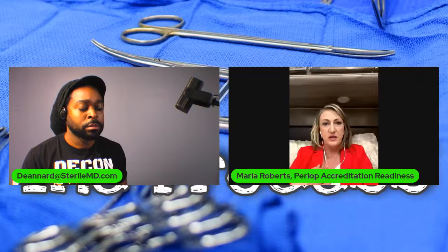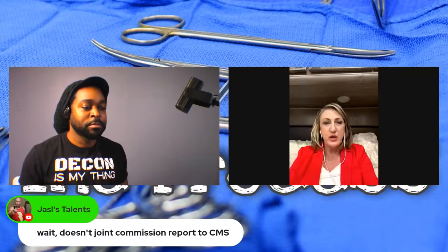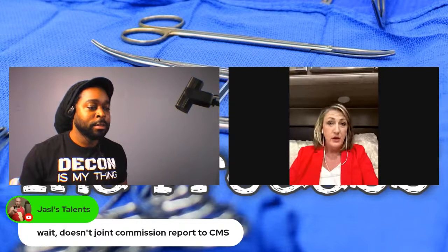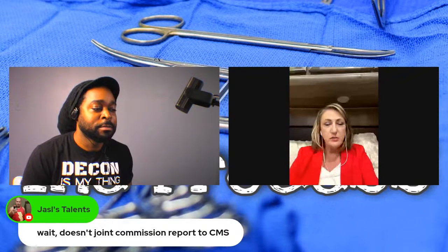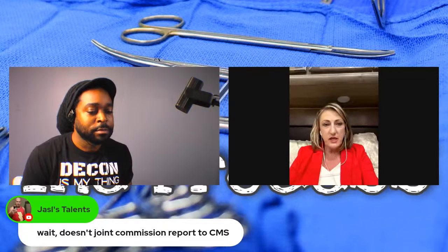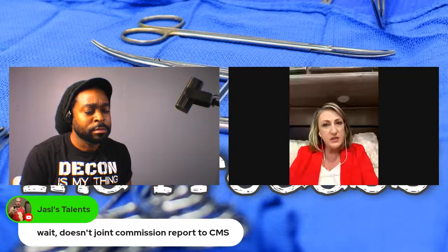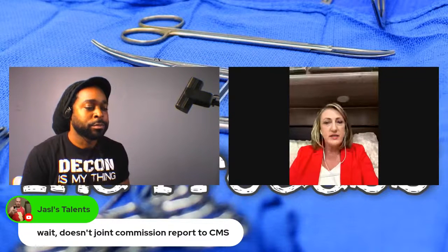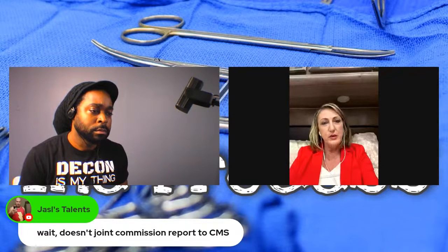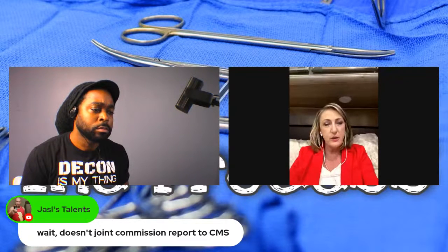We have to do things not because someone else tells us we have to do them. We need to be doing things in sterile processing because it's the right thing to do. Everything starts with you guys. You're the most important person, in my opinion, in the operating room, because the surgeon can't do his job if he doesn't have clean instrumentation. We end up with surgical site infections, all kinds of things. We're opening trays that still have blood and bone and things like that in them. Some of it is because they're not being cleaned. I saw a knee scope not long ago where they didn't have a borescope to check the lumens. And so we ask them, how are you doing it?